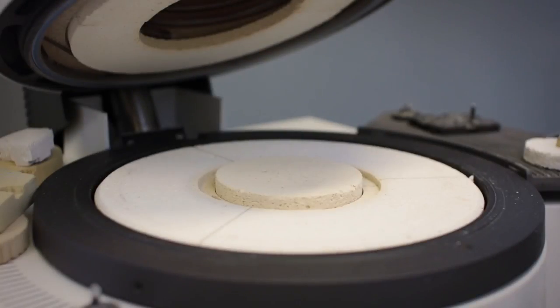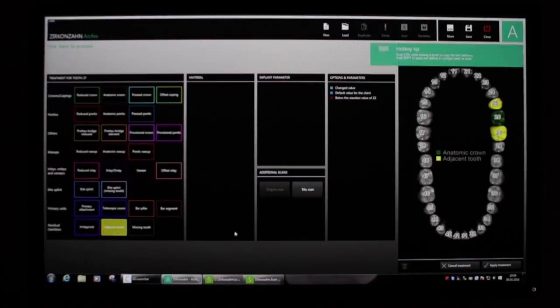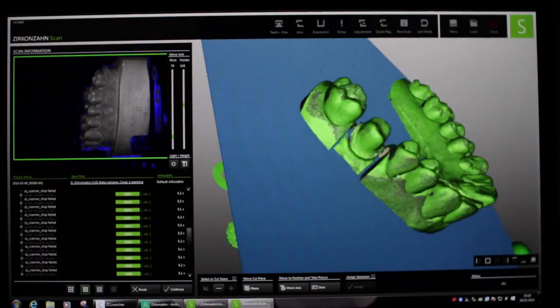This is an overview of the fabrication of a full anatomic zirconia crown. The model is scanned into the CAD-CAM software. The crown is designed on the software and milled.